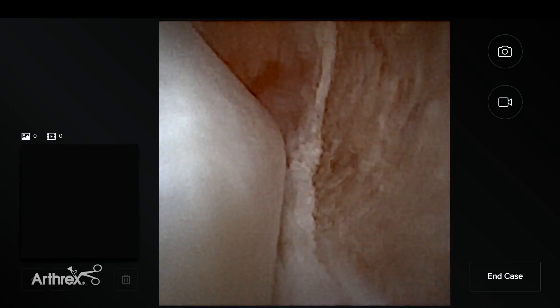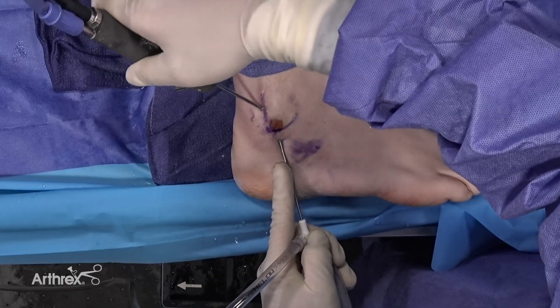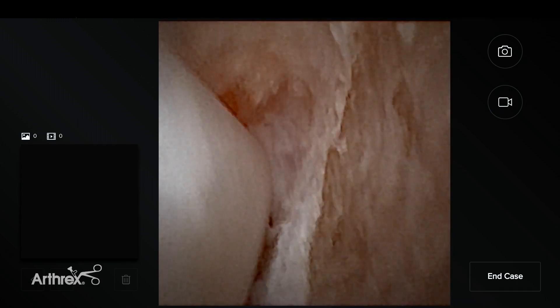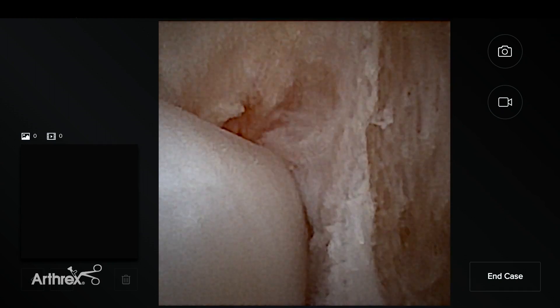My tip is that I like to use a torpedo shaver as the touch-up at the end. We're going to put a torpedo shaver in to make the area more smooth. That's the end result after the debridement of the posterior aspect of the fibula.